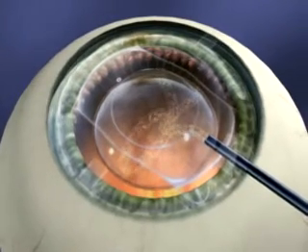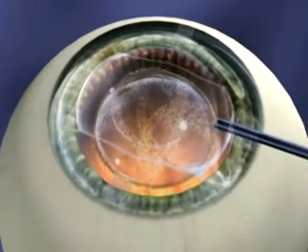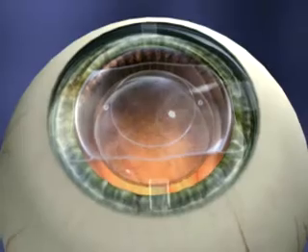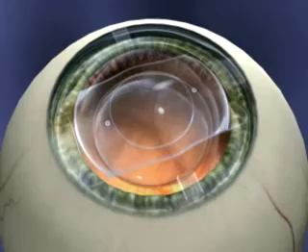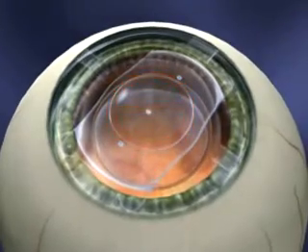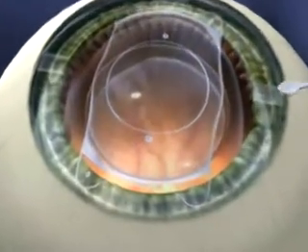Once the ICL has unfolded, inject additional viscoelastic on top of the lens to give yourself more room. Never inject viscoelastic underneath the lens. Now the ICL must be repositioned posterior to the iris plane via the paracentesis using the ICL manipulation instrument. Keep in mind that the central 6 millimeters of the ICL is considered the no-touch zone. Avoid going across the visual axis — manipulate on the peripheral area, never on the optic.